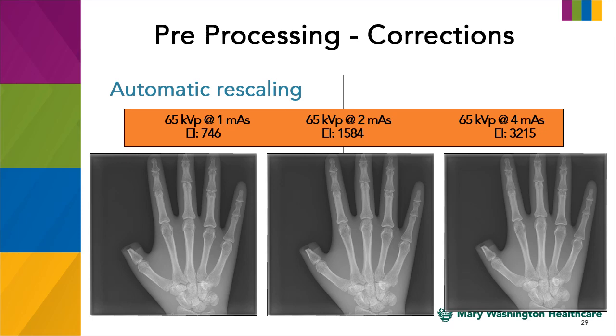We have 3 images that were taken here at different mAs values, and the EI number kept going up, but the overall image is the same. The brightness level is the same.